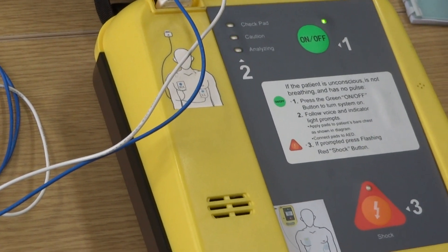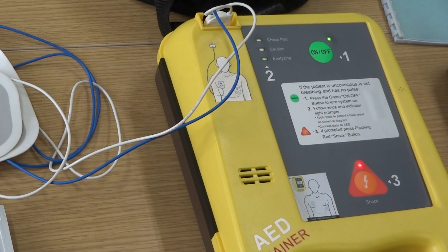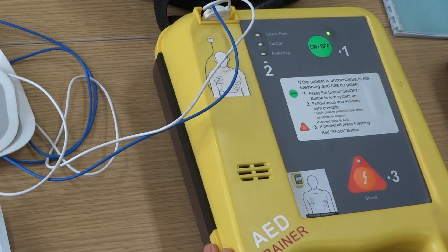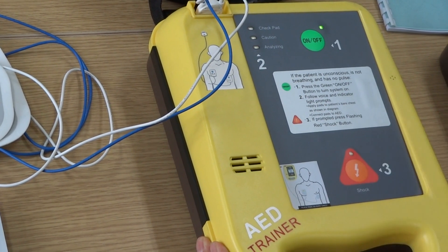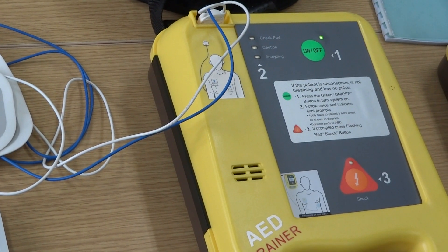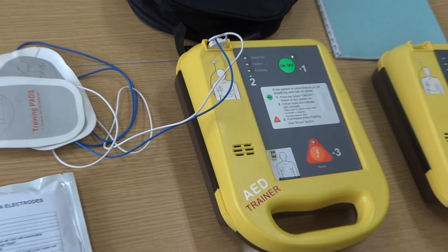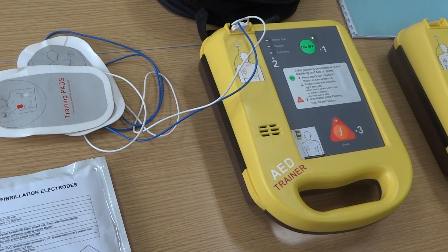Charging... analyzing whether the patient needs a shock. Press the flashing red shock button. This means the patient needs a shock. Shock delivered. Shock delivered. The patient may now be touched. Carry on CPR — perform 30 chest compressions and two mouth-to-mouth breaths, then repeat the cycle.